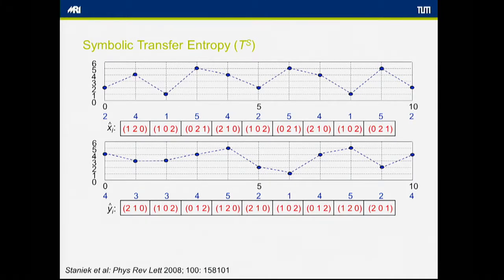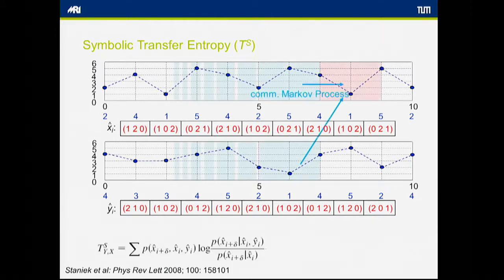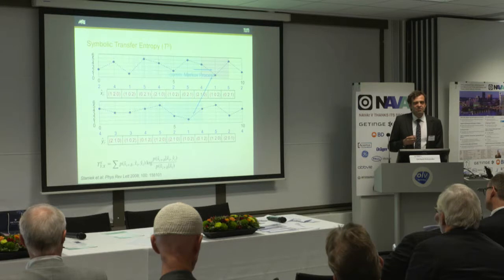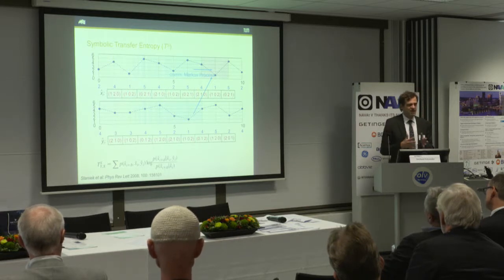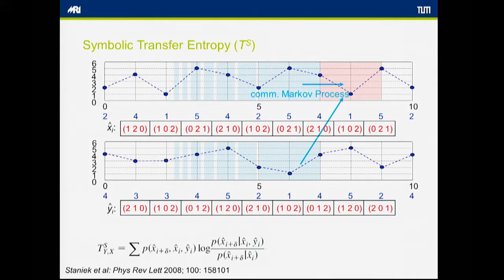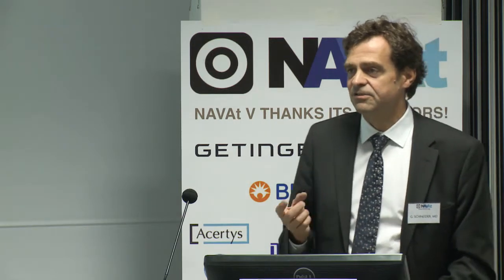Now, given that the EEG is a Markov process, which gives you the ability to predict what will happen in the EEG based on what has happened up to this point. So looking at the past, you can predict what will be in the future of the EEG activity. You can calculate this future behavior of the EEG, and then compare it to the observation, what really happens to the EEG. And you will find a difference.